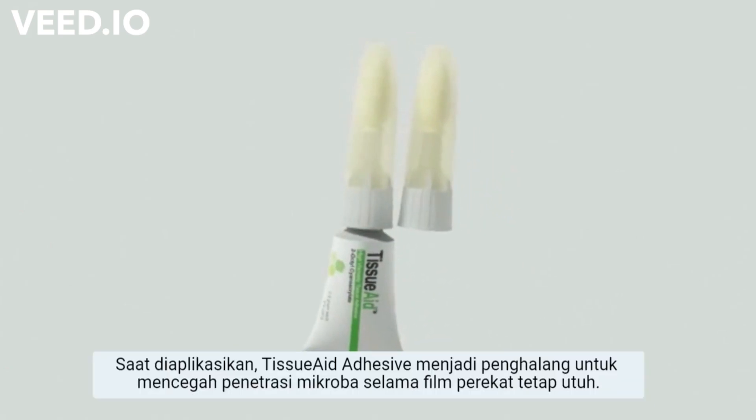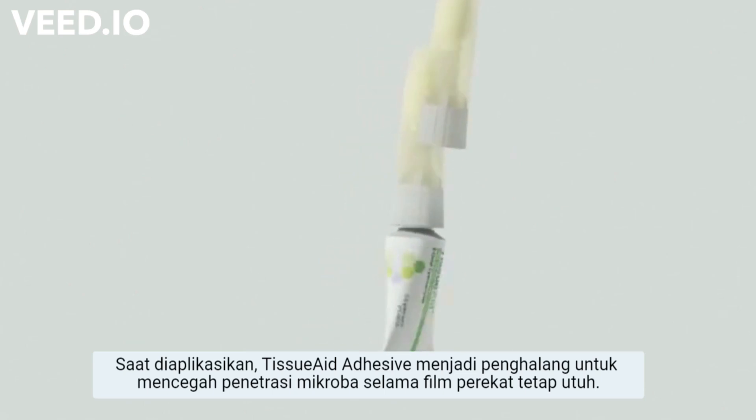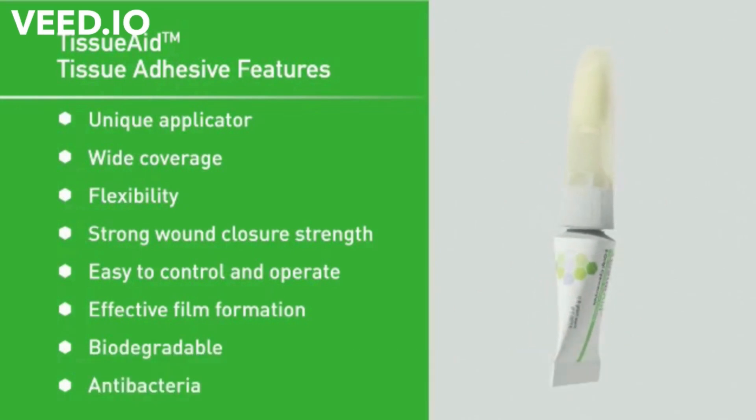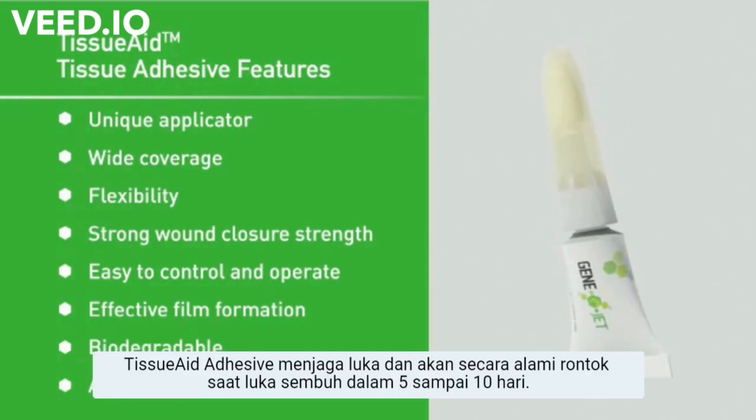Once the tissue adhesive is in place, it protects the wound by providing a flexible protective barrier to prevent microbial penetration for as long as the adhesive film remains intact. Tissue adhesive secures the wound and will naturally fall off as the wound heals in 5 to 10 days.